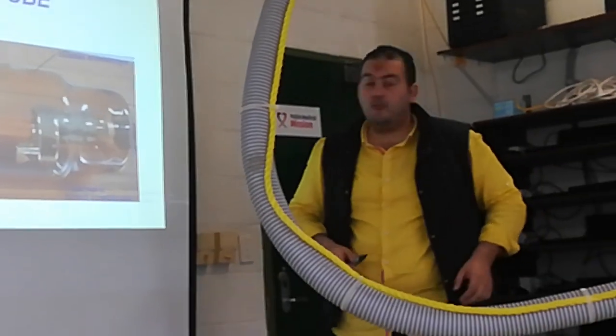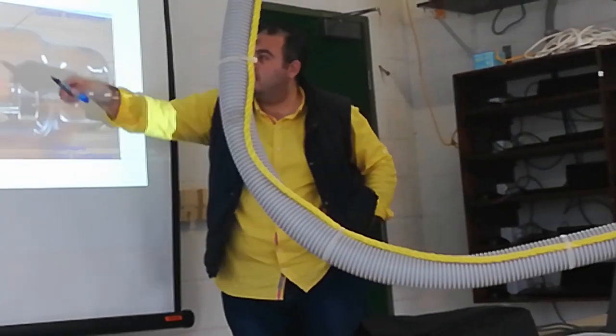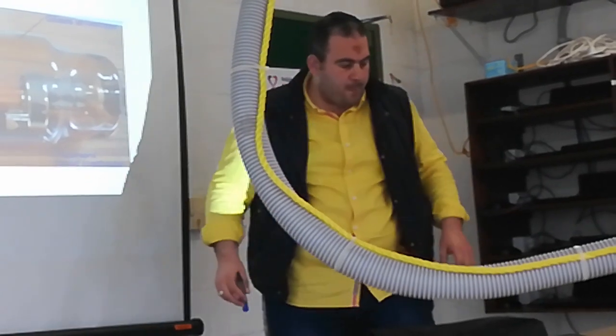This is the X-ray tube. You'll find here the anode and the cathode in an evacuated tube.